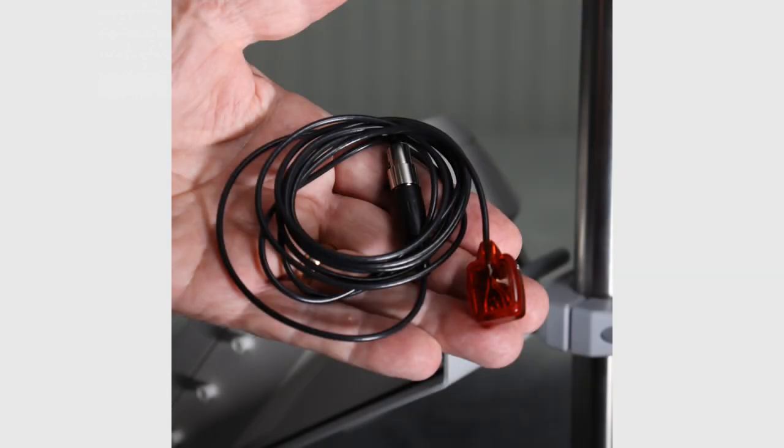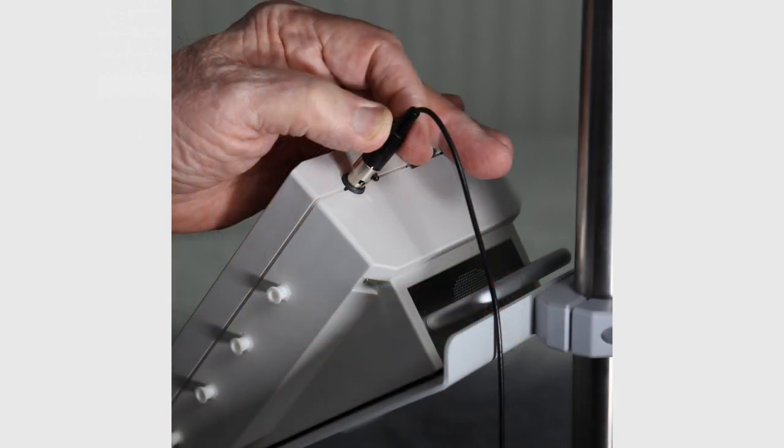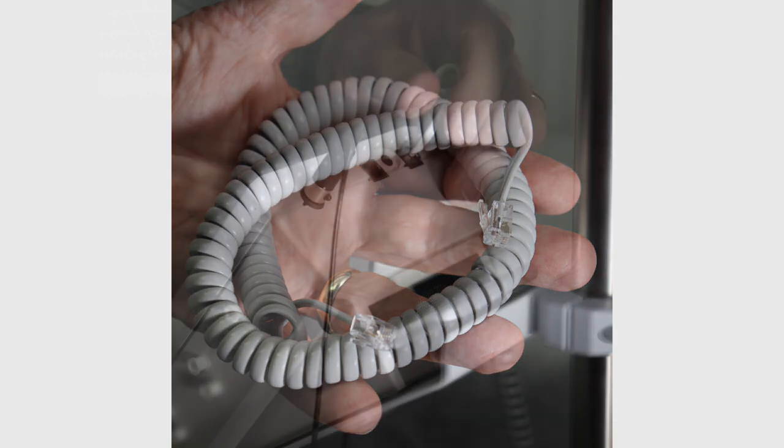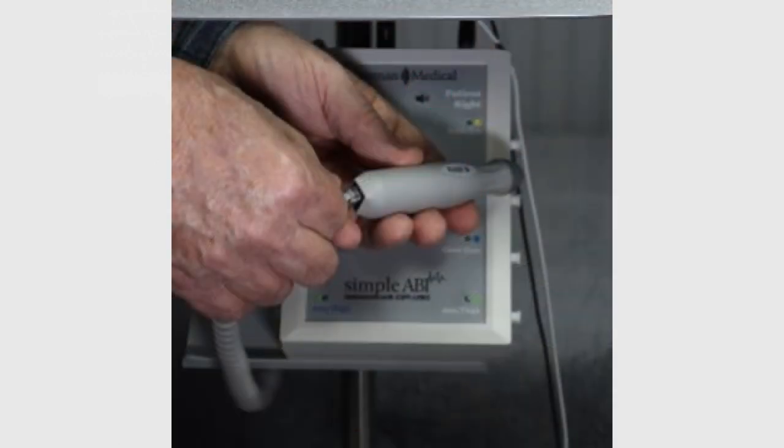Locate the PPG probe and attach it to the cufflink. Locate the Doppler probe cord. Attach the Doppler probe cord to the cufflink and then the other end of the cord to the Doppler.